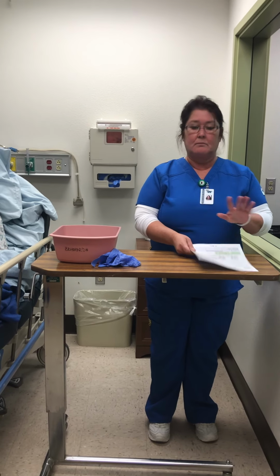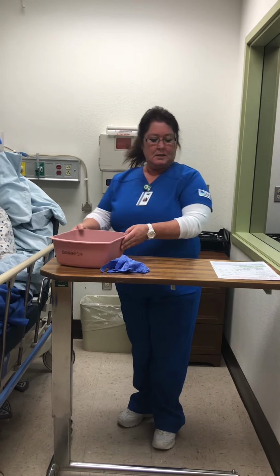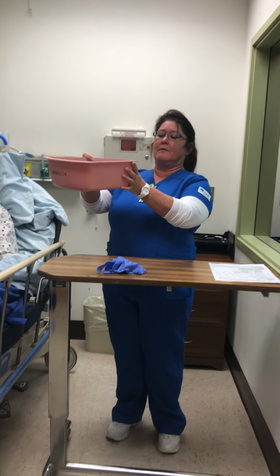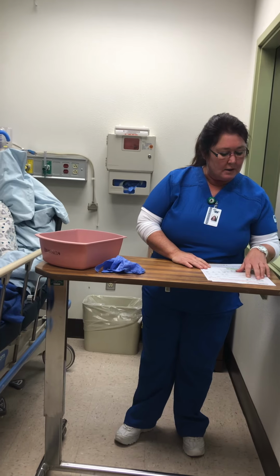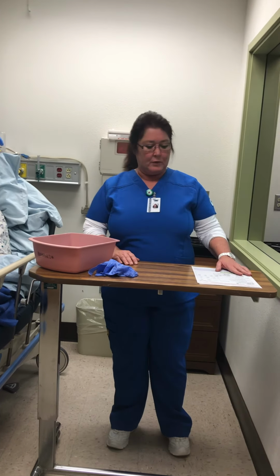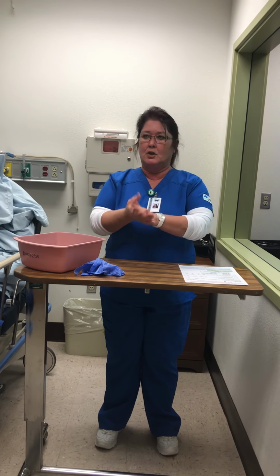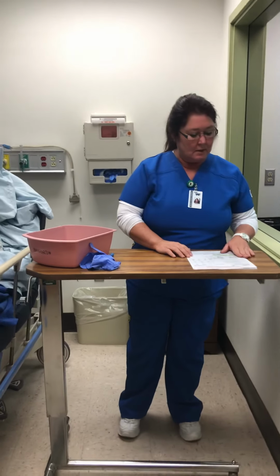So now that I've double checked and there are no discrepancies, I am going to grab the meds, and we have Shirley Cost 514.1964. I have Shirley Cost 514.1964, and I'm going to perform my first med check. So I have performed hand hygiene, and I am now going to pull the medications.